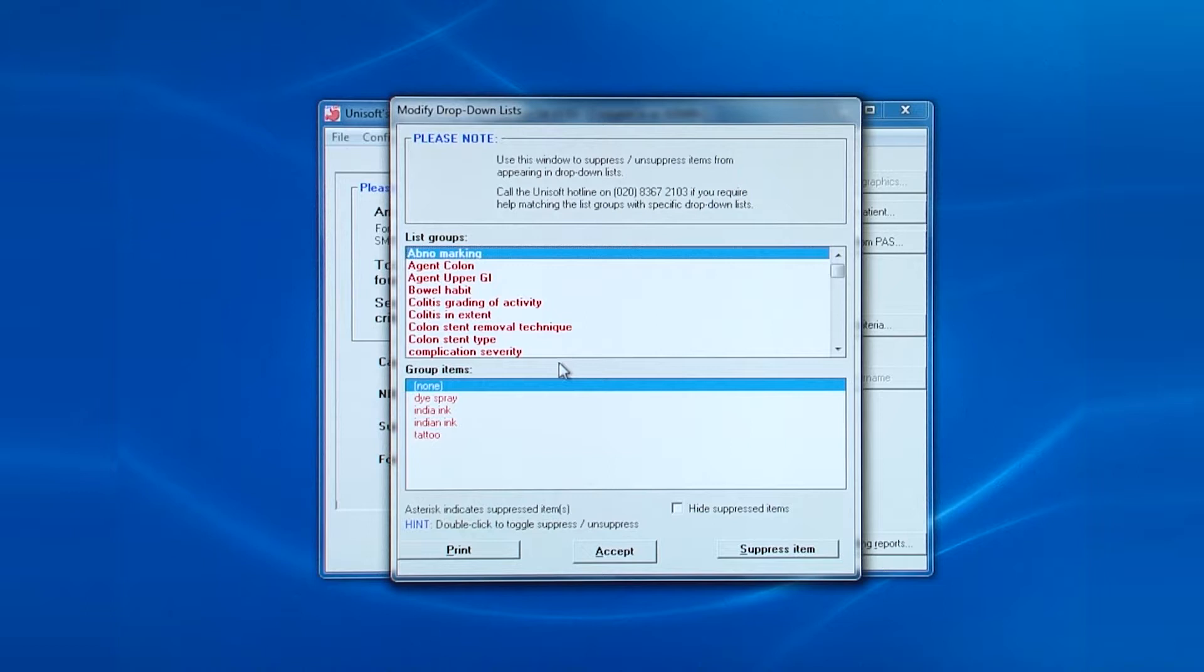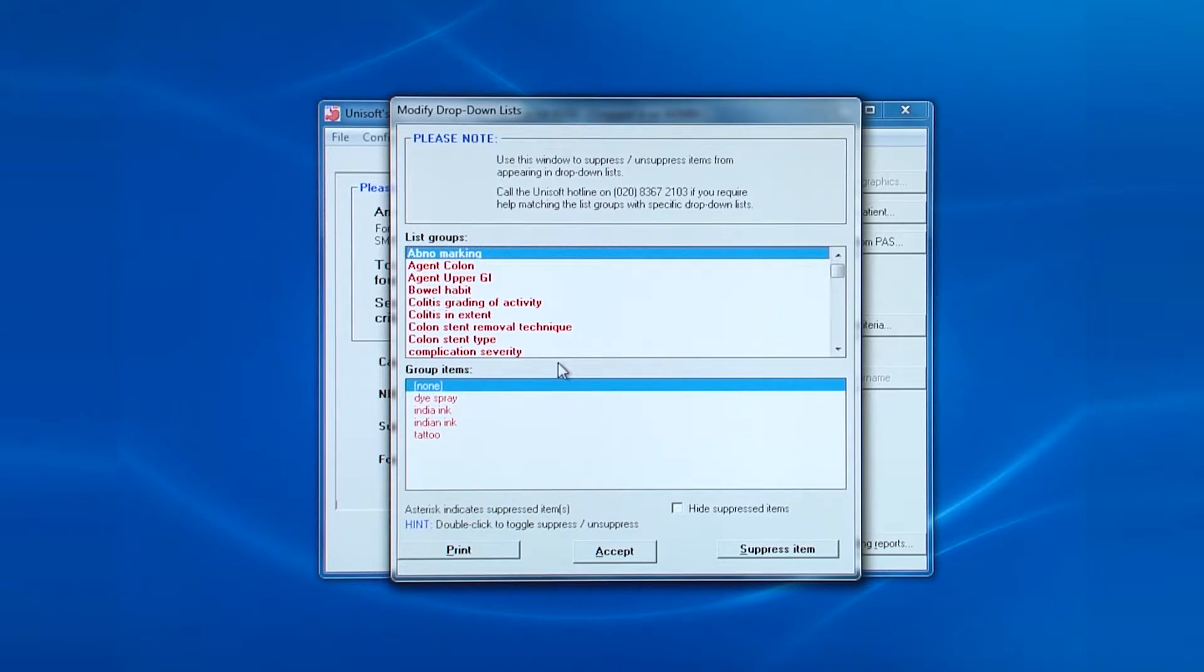What you can do here though is suppress items from appearing in the drop-down lists for all new reports. If you go back to previous reports, you will still see all entries in the drop-down boxes.